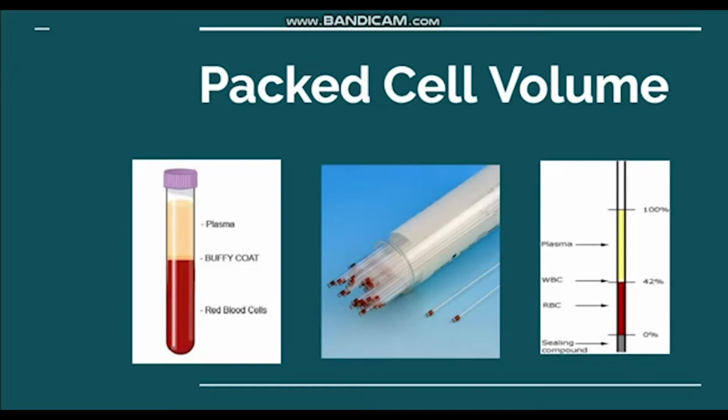Hello everyone, in this video we will discuss packed cell volume or hematocrit. Now what is packed cell volume? Whenever we get an EDTA sample of blood, if we centrifuge it, the volume of the red blood cells, this is the packed cell volume, this is the hematocrit. Okay, and we will discuss this in detail.